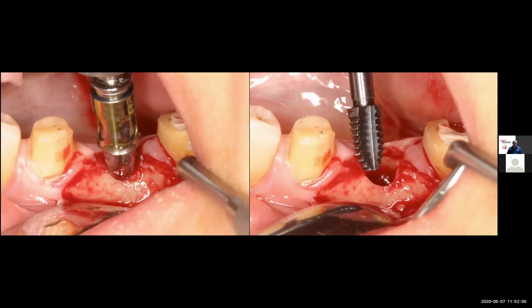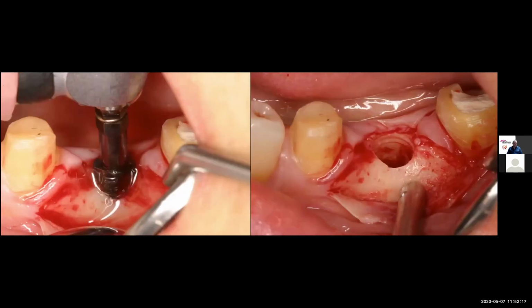Drill down to the depth, and then the bone is tapped. Remember, this is probably the bone biotype of thick bone with thin tissue. That tap is now going to give us the thread design that we see here in the bone that will be the intimate contact of the implant to bone.